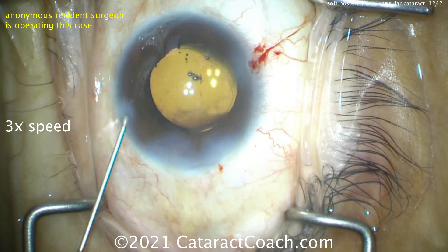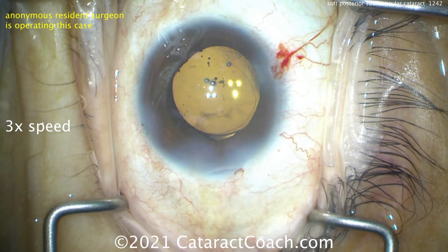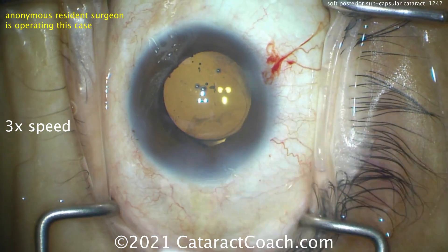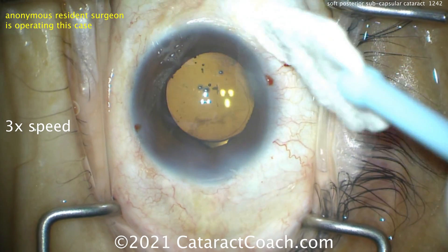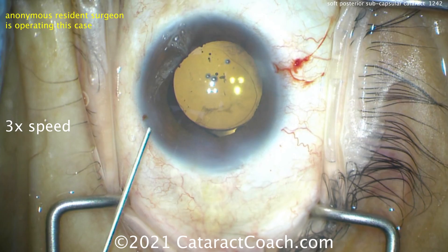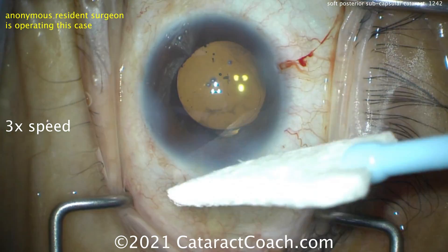I don't like that hydration — just the side walls of the incision — because now look at the center of the main incision, it's the only part that's not hydrated. Maybe do a little more hydration there in the center. It looks like it seals up anyway, but a lot to be learning here. Good job with this young resident for a nice looking case — keep up the learning.